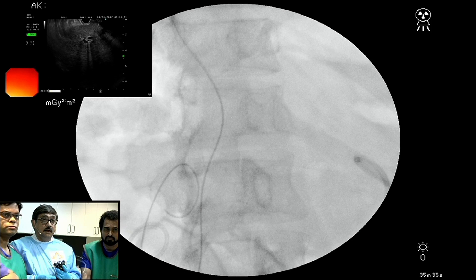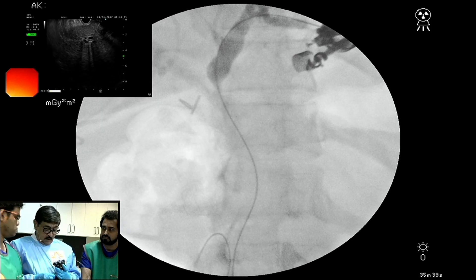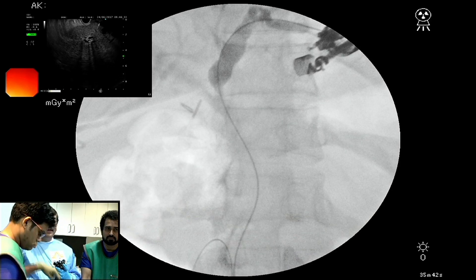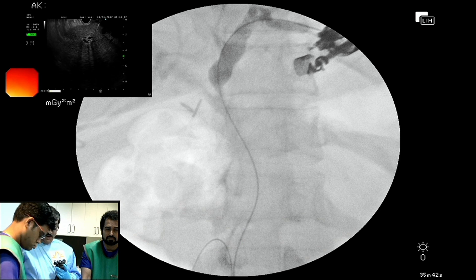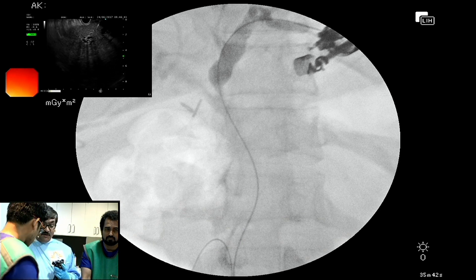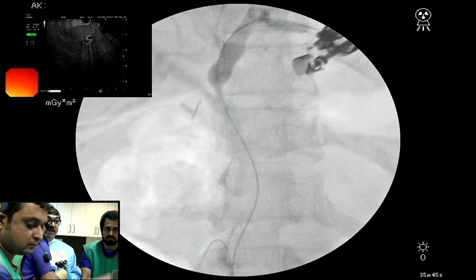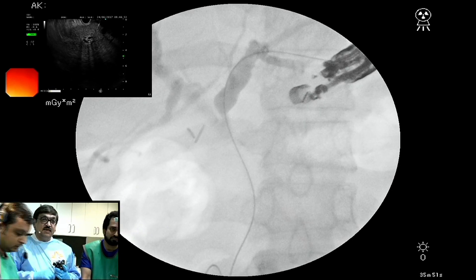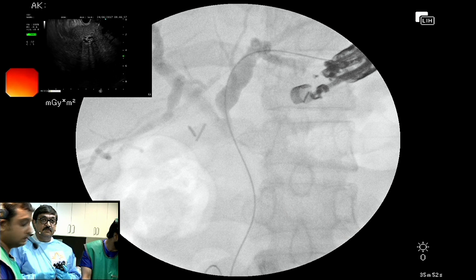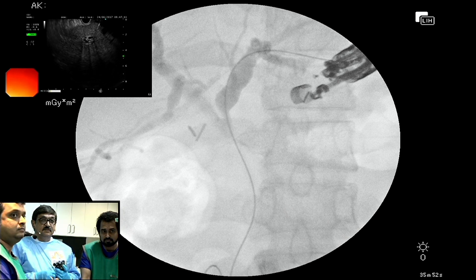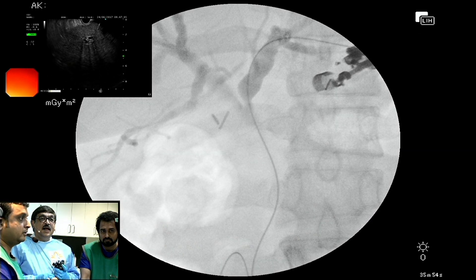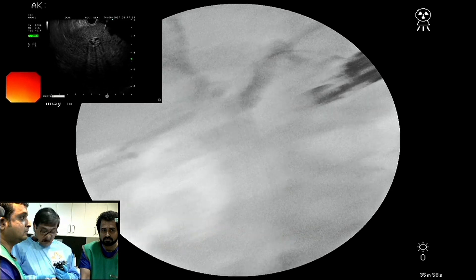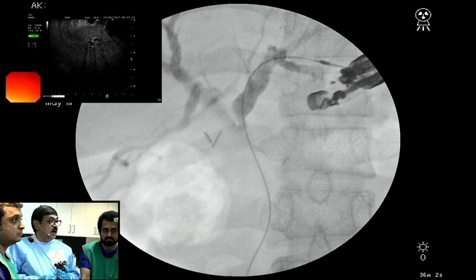What would be the theoretical advantage of using EUS instead of ERCP in this patient? Really no advantage. ERCP has failed once outside, so we have an indication to do an EUS-guided procedure — but otherwise, ERCP is as good in this patient. Is it not true that the risk of pancreatitis is less with EUS? With trans-luminal procedures, based on our experience of 200-odd patients, the pancreatitis rate is about 2.5%.